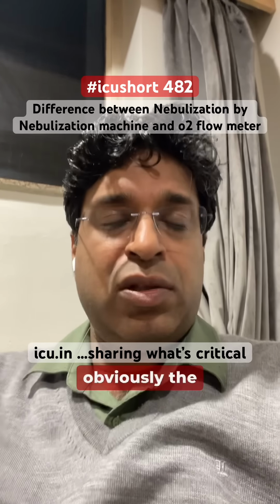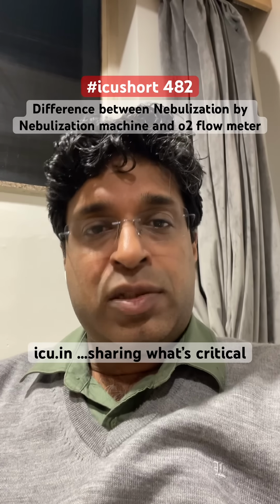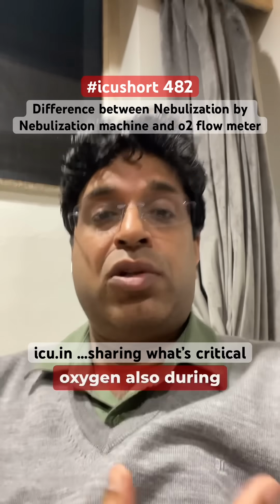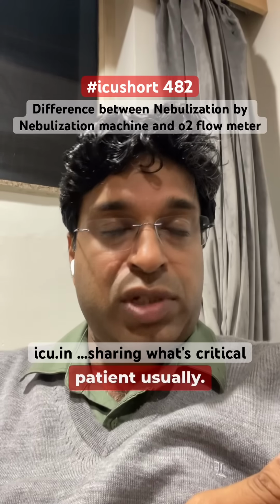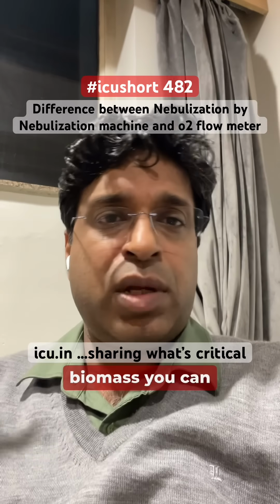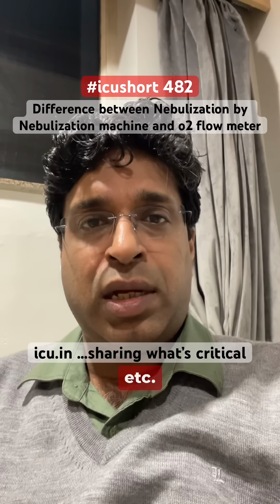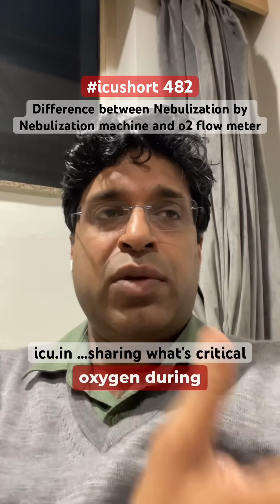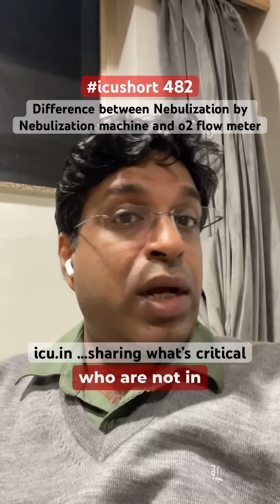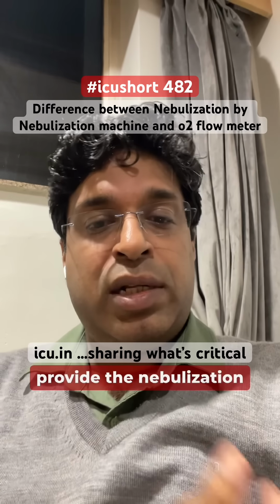the nebulization, obviously the oxygen by flow meter should be used because it provides oxygen also during the nebulization. While the nebulization machine provides nebulization usually for the stable patient. Though, if you are giving by mask, you can put a nasal prong additionally, which can provide oxygen during the nebulization.